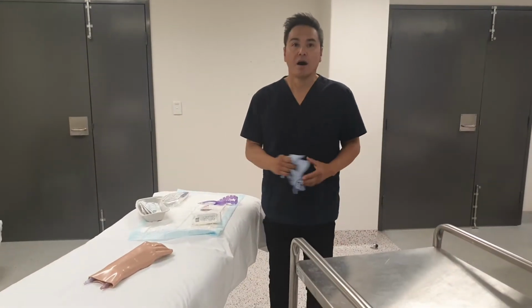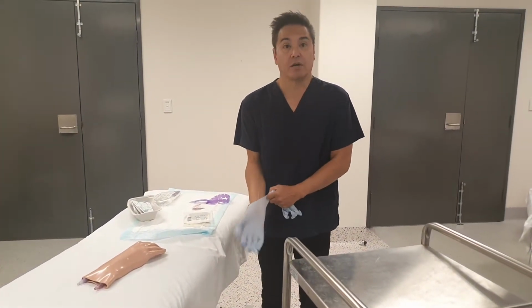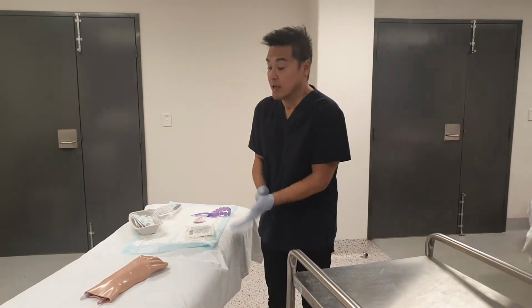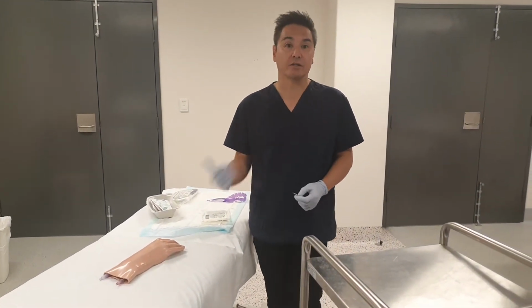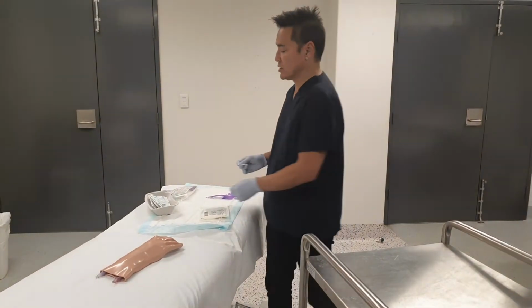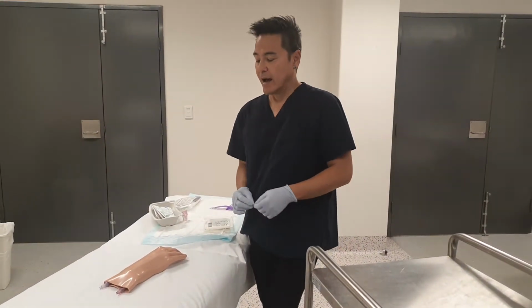One, go. Hi guys, we've decided to load up a video of your mastery, which is going to be IV cannulation, and we want to have a look at a lot of the aspects of IV cannulation. So when I put a cannula in, I make sure that I introduce myself to the patient. They can see my ID and all that sort of thing, and I'll discuss with my patient what I'm going to be doing and what that involves.